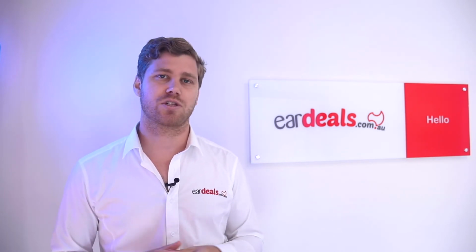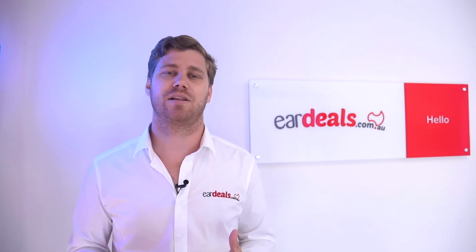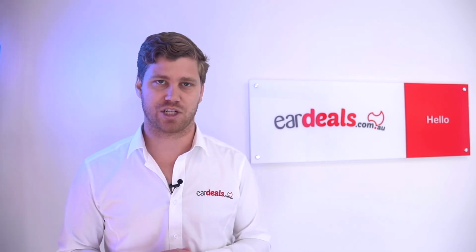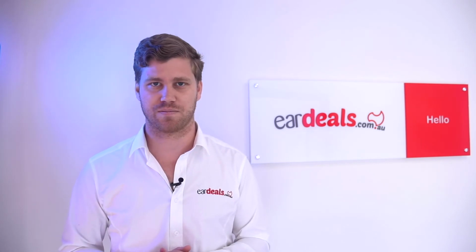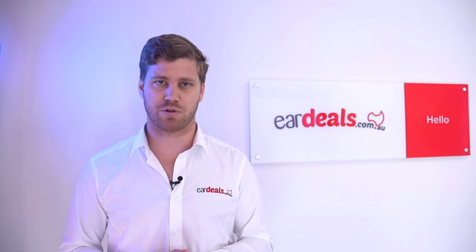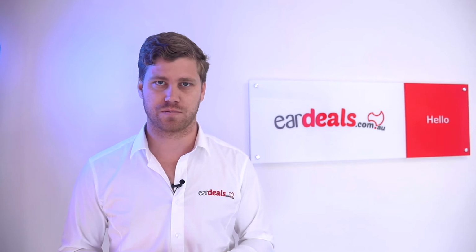So if you're somebody that struggles with small replaceable batteries, then you're really only handling something the size of a hearing aid. So you simply place the hearing aid in the charger case, close the lid, and then place that case on the induction charger. All in all, it's a great option for those seeking rechargeable devices that are easy to use, who have dexterity issues.